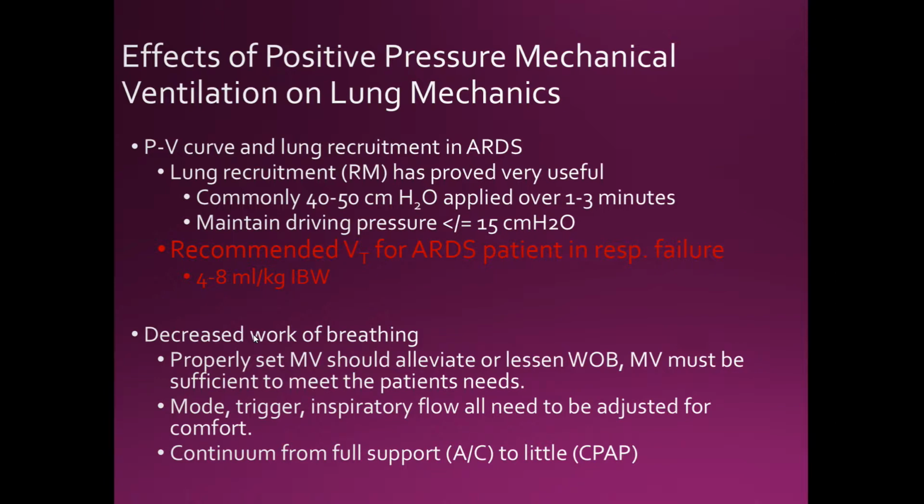So when they take a breath, they're taking a negative 1 breath, and then the machine will kick in. That will correct their increased work of breathing. Now, to correct their auto-PEEP, you will increase the flow on volume control. When you correct the flow, it should get rid of the auto-PEEP, and the patient should go back to a baseline of plus 5.